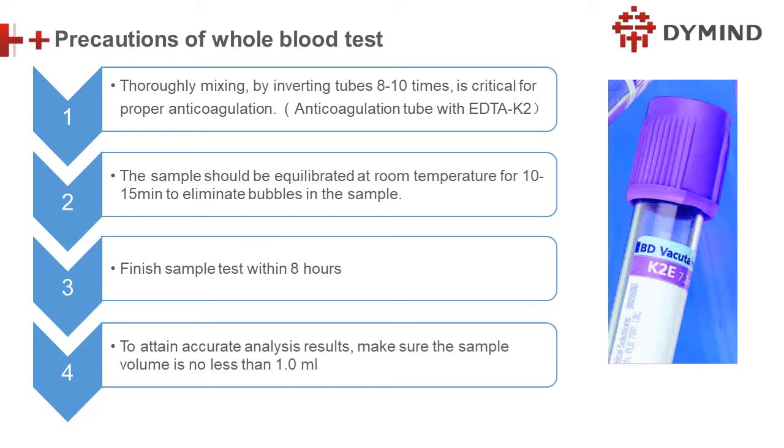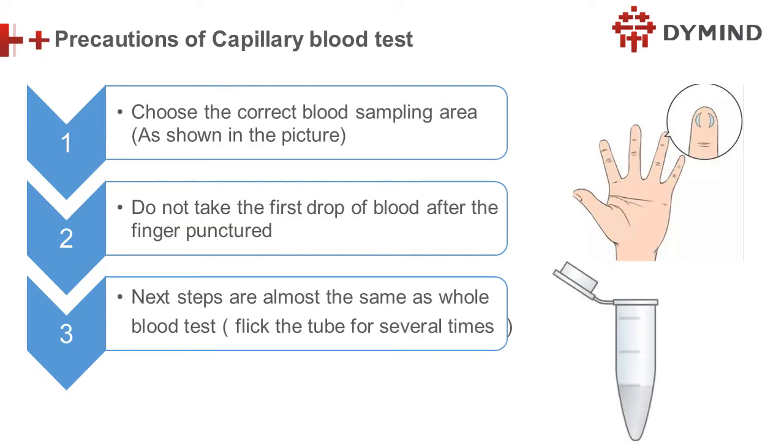That means if it's too less, there will be some problem. Okay, here are the precautions for the capillary blood test. What's the difference? There are three more precautions here.